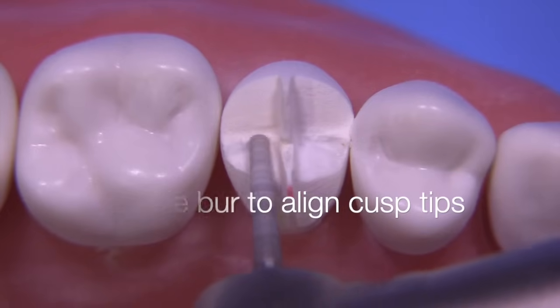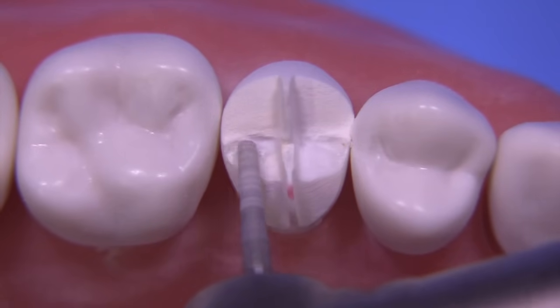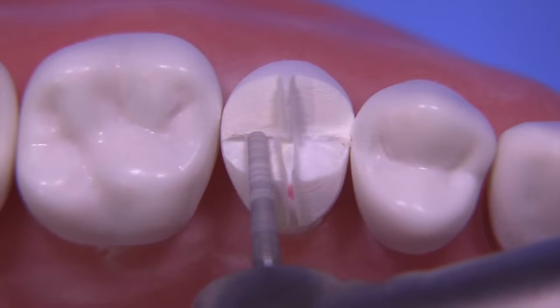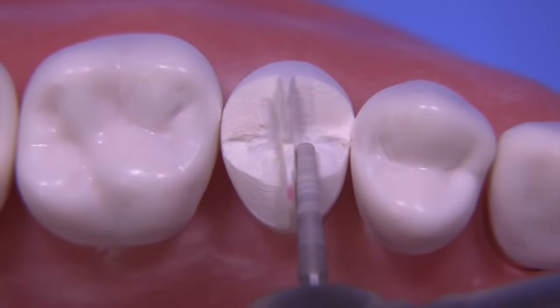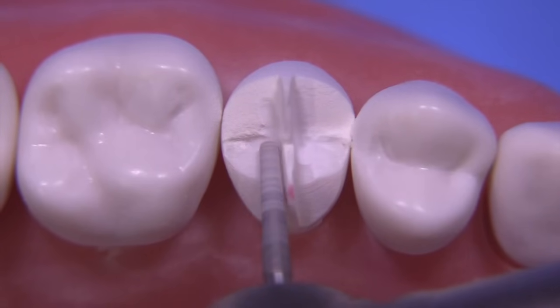We want to angle the bur in such a way that we align the cusp tips of the unprepared adjacent teeth, and once again not touching that middle portion — the tenon.